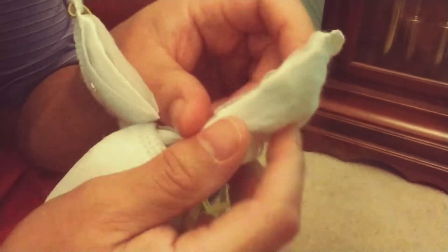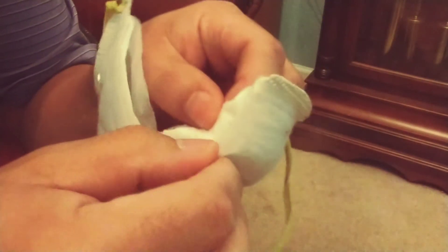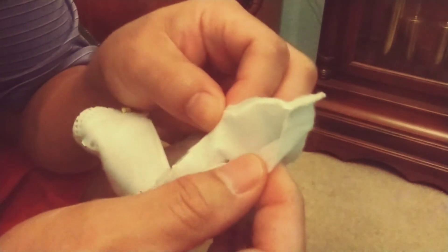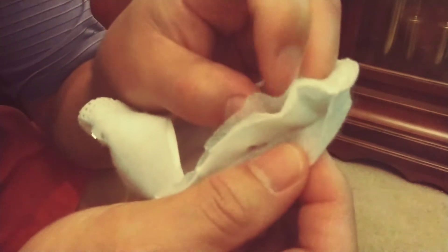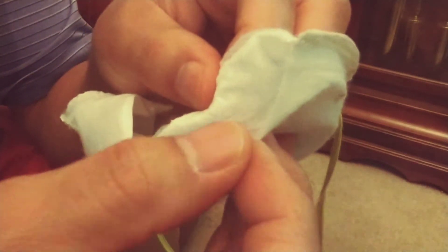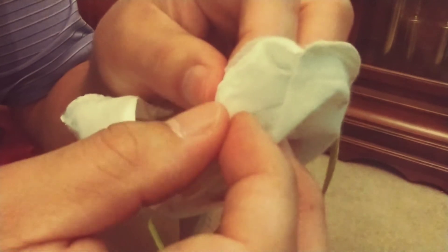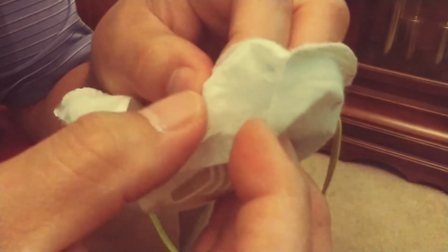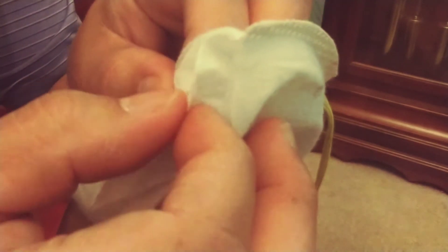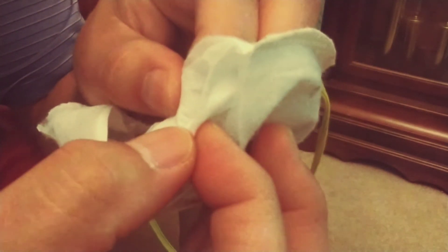This is what it looks like on the inside. You've got one pretty rough outer part, and then you can see another very thin layer. Then you've got a layer that looks like it can catch bigger particles. Then you get tinier layers — it comes like a cotton in there.